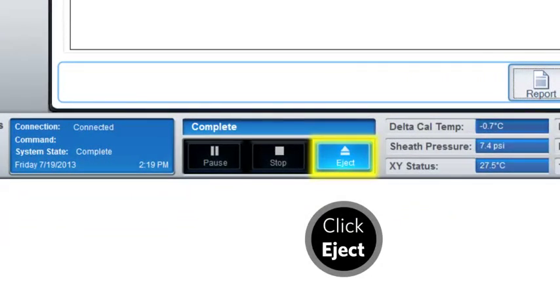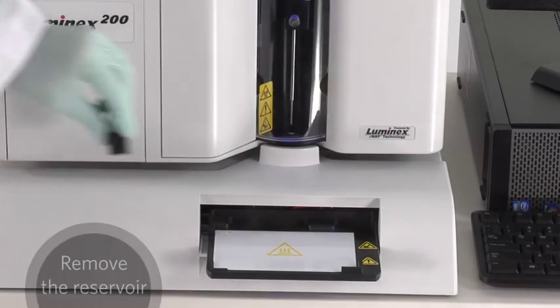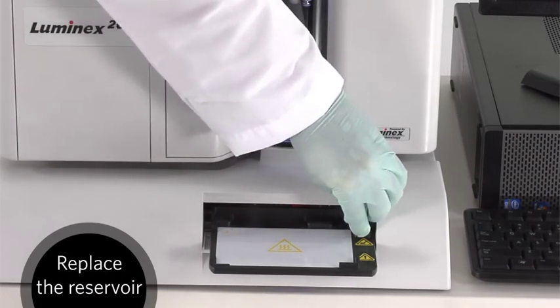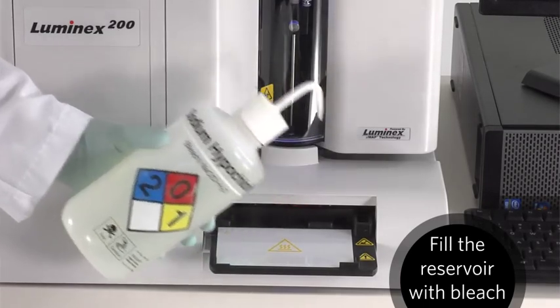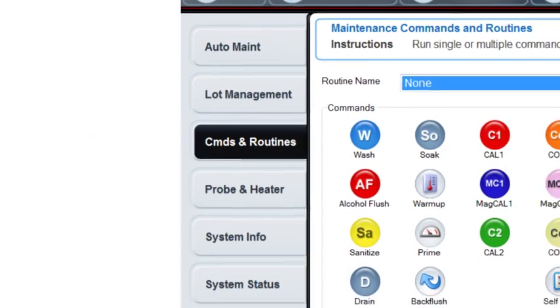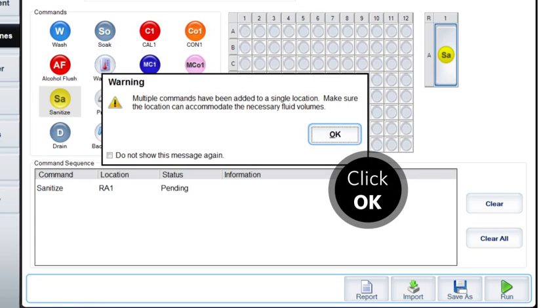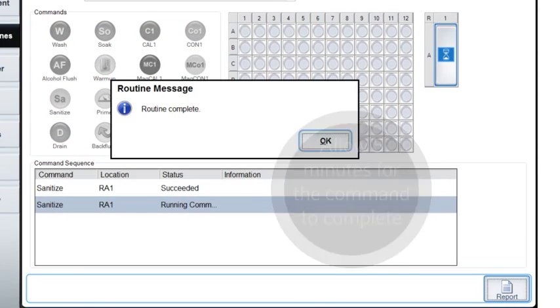Next, we do the same thing with diluted bleach to sanitize the lines. Eject the plate holder. Empty out the remaining sodium hydroxide from the reservoir. Replace the reservoir and fill it with a 10 to 20 percent bleach solution. In the routine section, click on Sanitize twice. Click OK. Verify the reservoir is selected on the plate layout. Click Run. Click OK.